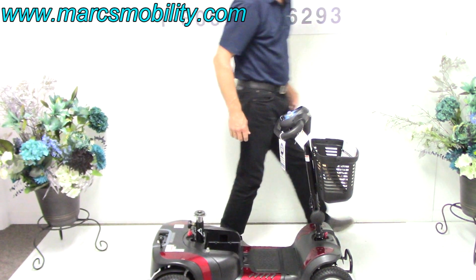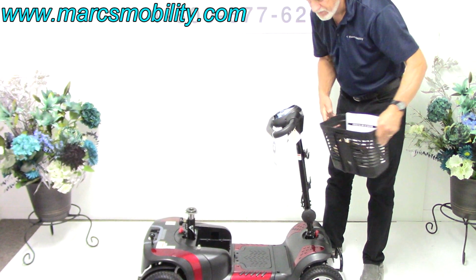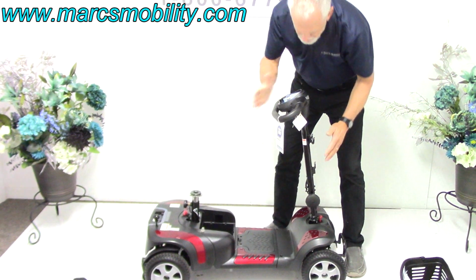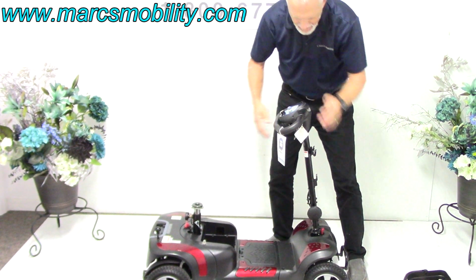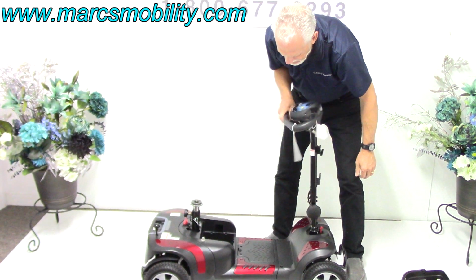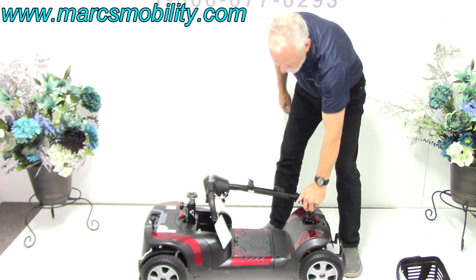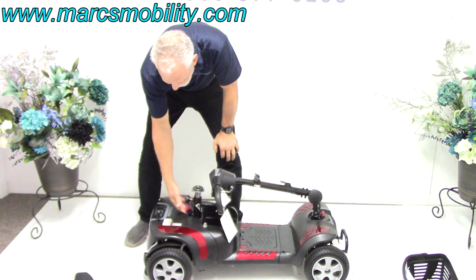The next thing I would do, I'm doing this slow so you can see how easy it is. Pull the basket, which weighs nothing. Then I would pull the tiller down, and this is adjustable, so whenever you're in your seat, you can always adjust this tiller forward or back right here. You can put it anywhere you want. I'm going to lower it down so when you take your scooter apart, you don't have it sitting up going in your car. Now, back here, there's a little lever, a red lever.